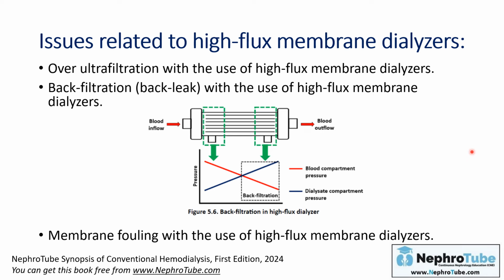The last issue related to the use of high flux membrane or dialyzers is membrane fouling. I mentioned before, while I was discussing the different types of membrane dialyzers, that the synthetic membranes, and actually the high flux dialyzers, are formed of synthetic membranes.